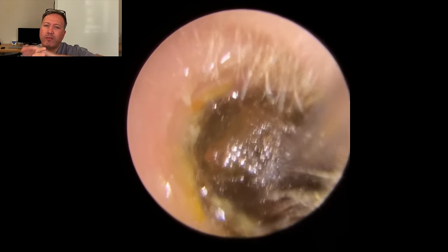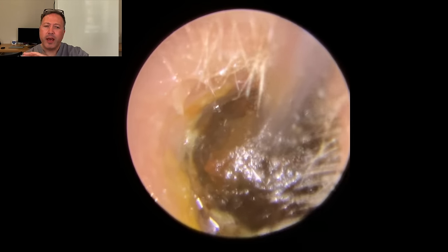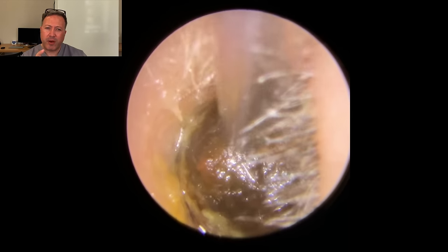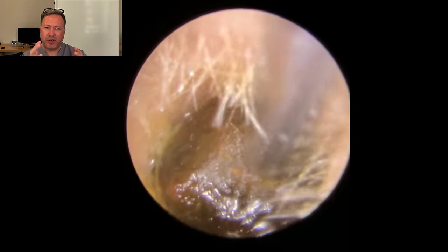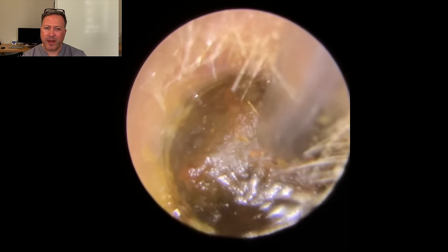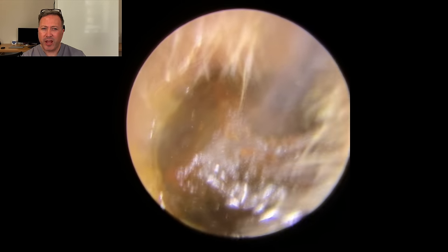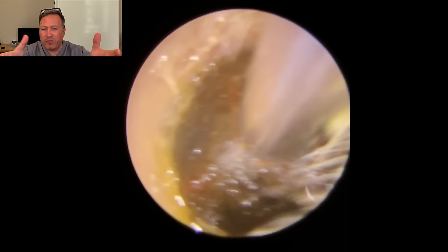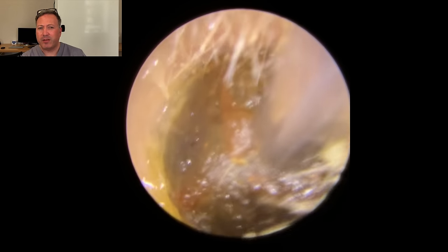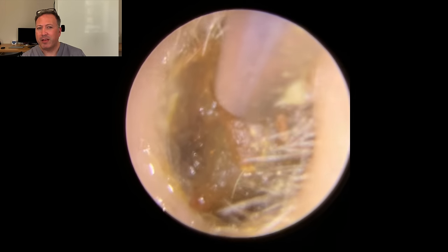So if we put a layer of olive oil over this, we're just going to spray some surgical grade olive oil in here. And then what happens is it coats the outer part of this wax and helps to slide it across the skin a little bit better, but it also helps us to get a better grip as well. You can see we're just gently rocking this up and down, which works the oil down the side of the wax, but also helps us to get a little bit more maneuverability. There you go, you can see it coming towards the outer part of the ear canal.